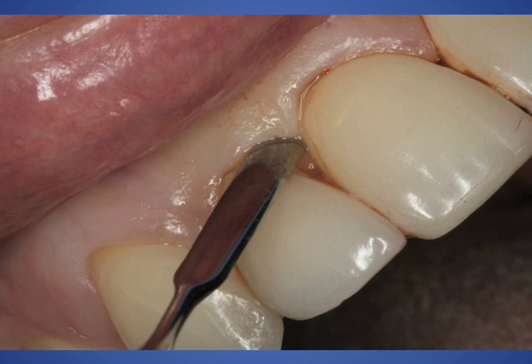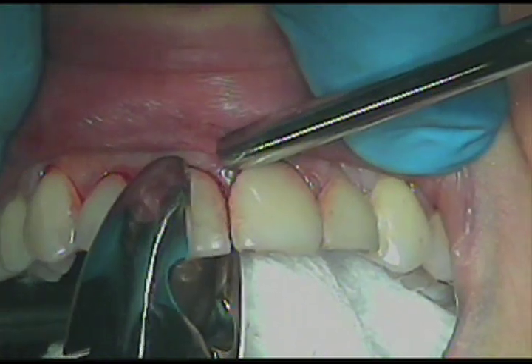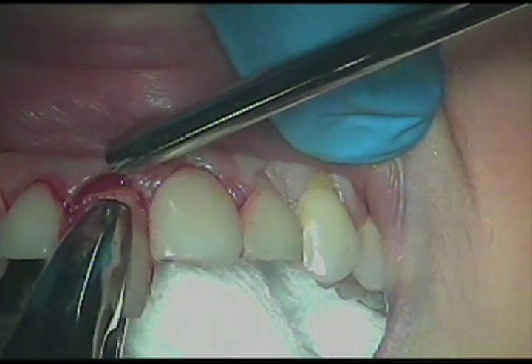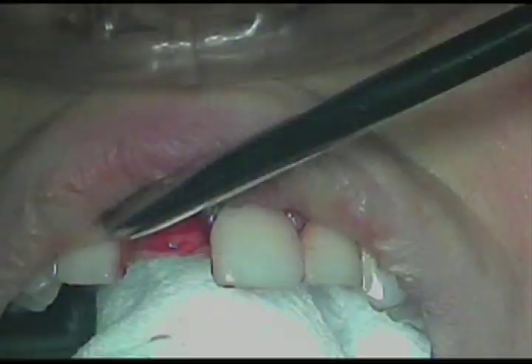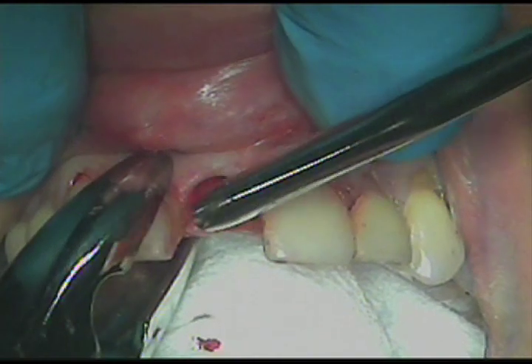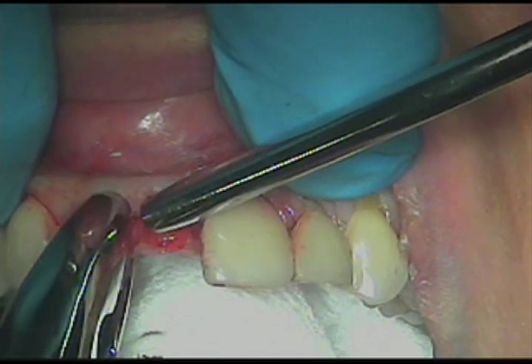Here we're using a periotome to simply break the periodontal ligaments around the teeth that we are going to extract. And let's run a little video here. On the extraction, we want very careful extraction. We take a lot of time in removing the teeth so as not to disturb the buccal plate at all. We have a nice clean extraction, trying to, again, maintain the interdental papilla as possible.